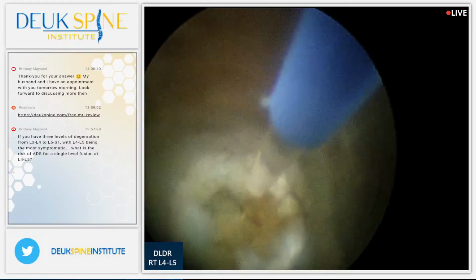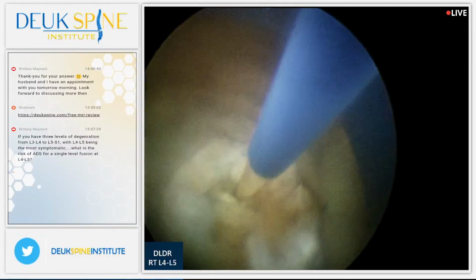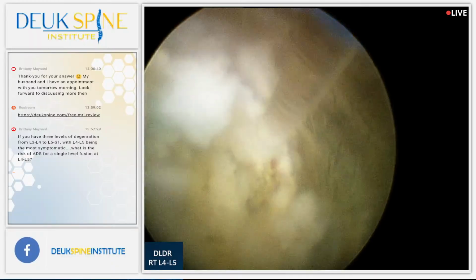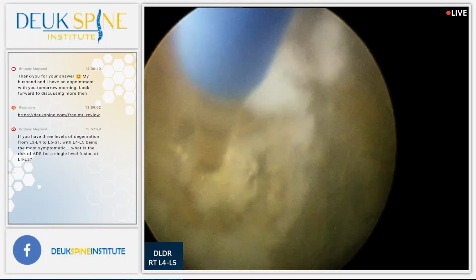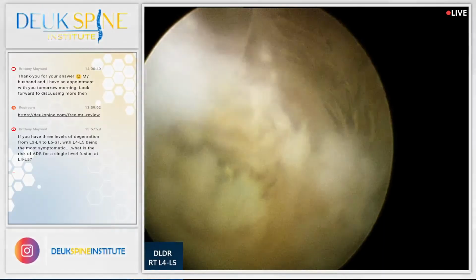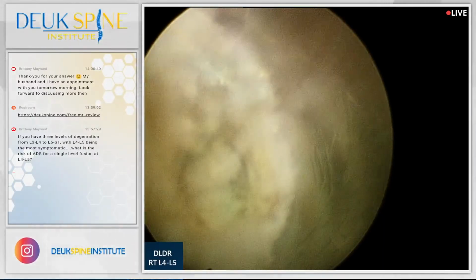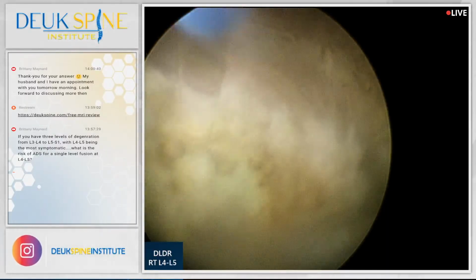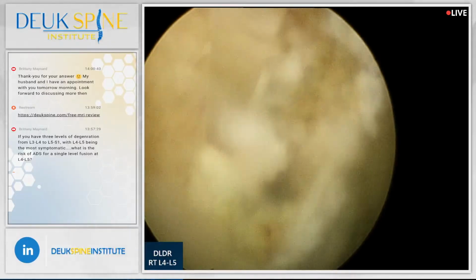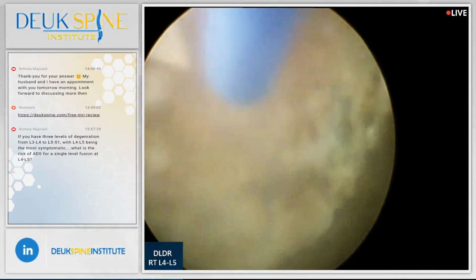Some surgeons who do laser surgery like side firing lasers, but there's nobody in the United States that does that. I'm the only one using the laser to repair discs currently. There are side firing laser fibers as well. I don't like them, I don't use them. This is a much better option. It works. Where are we at? 52.5? Yes, sir.